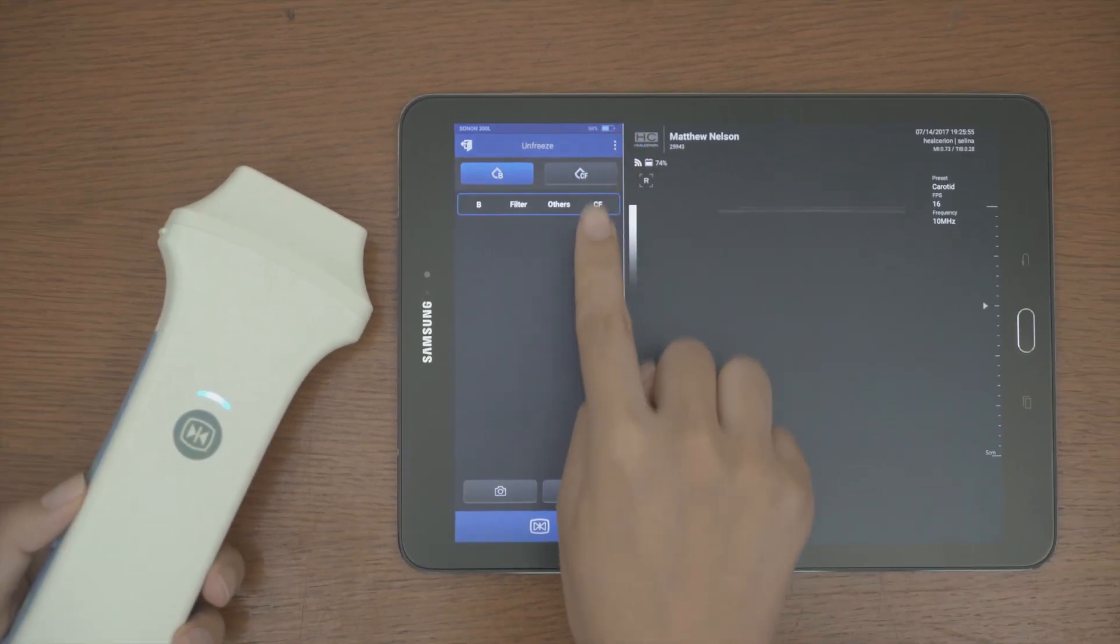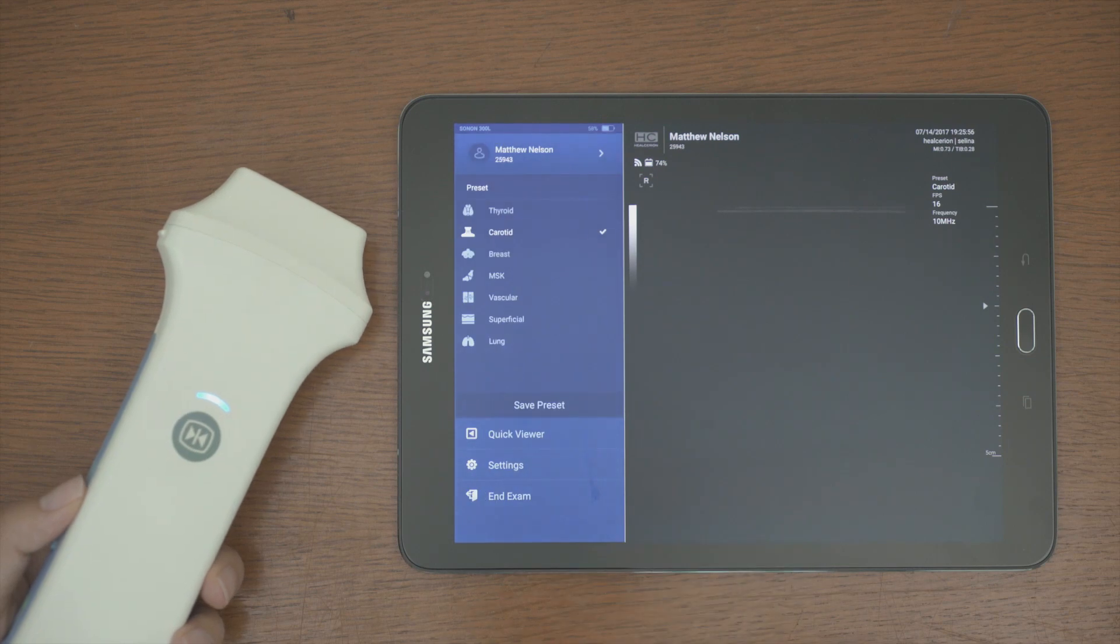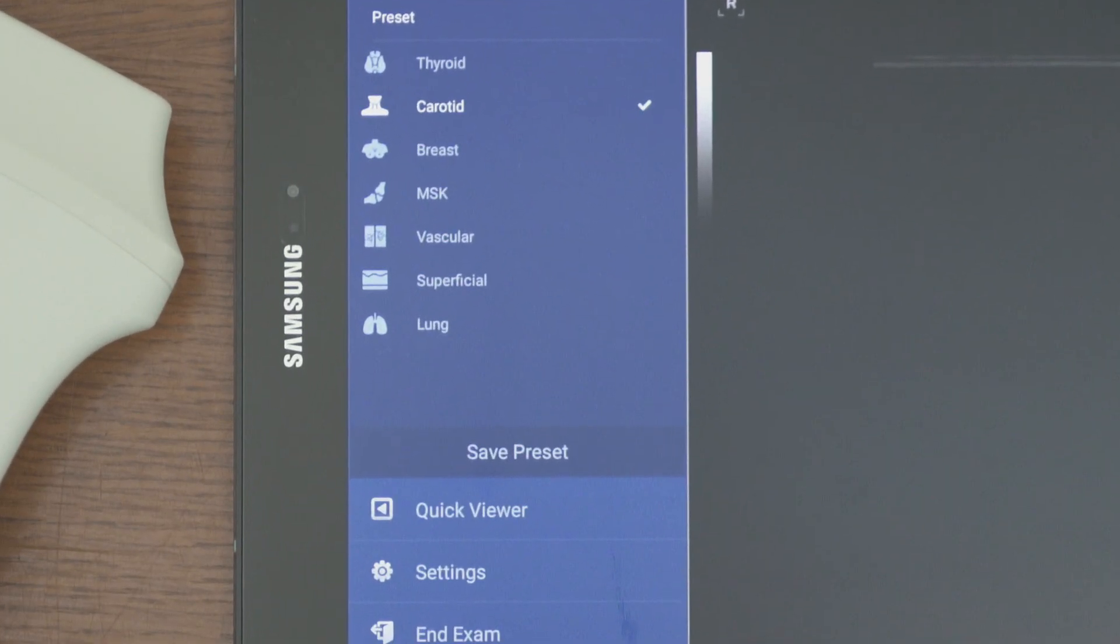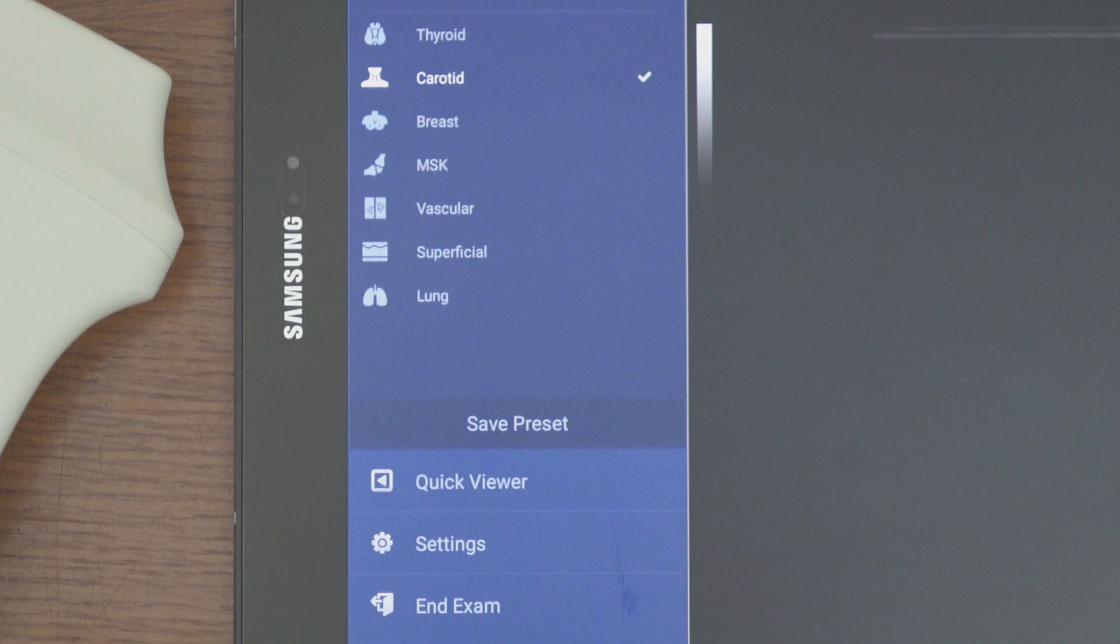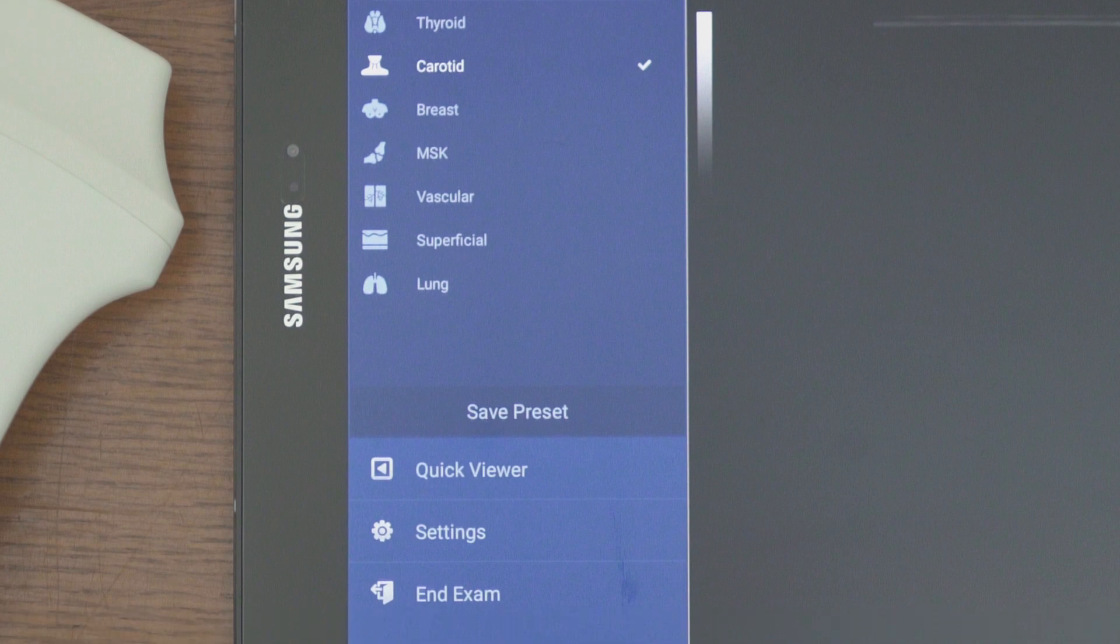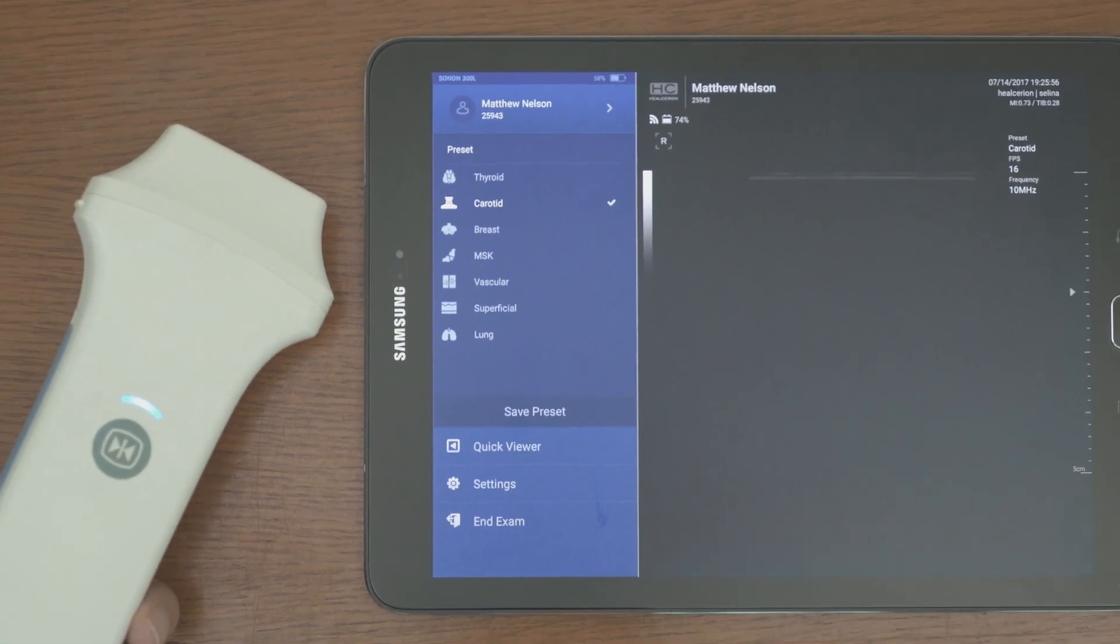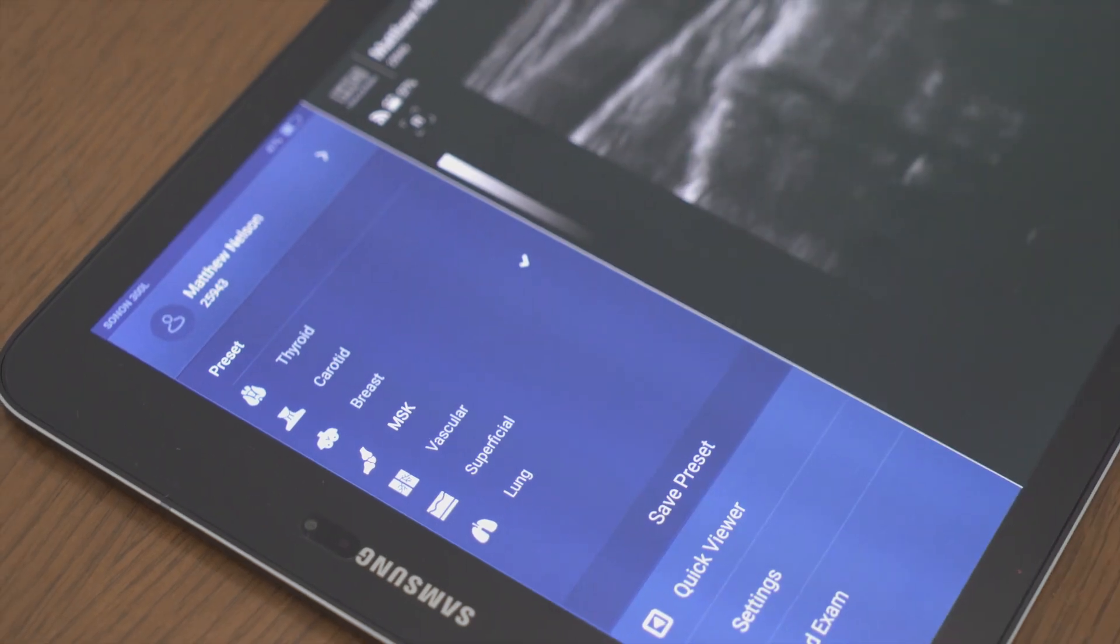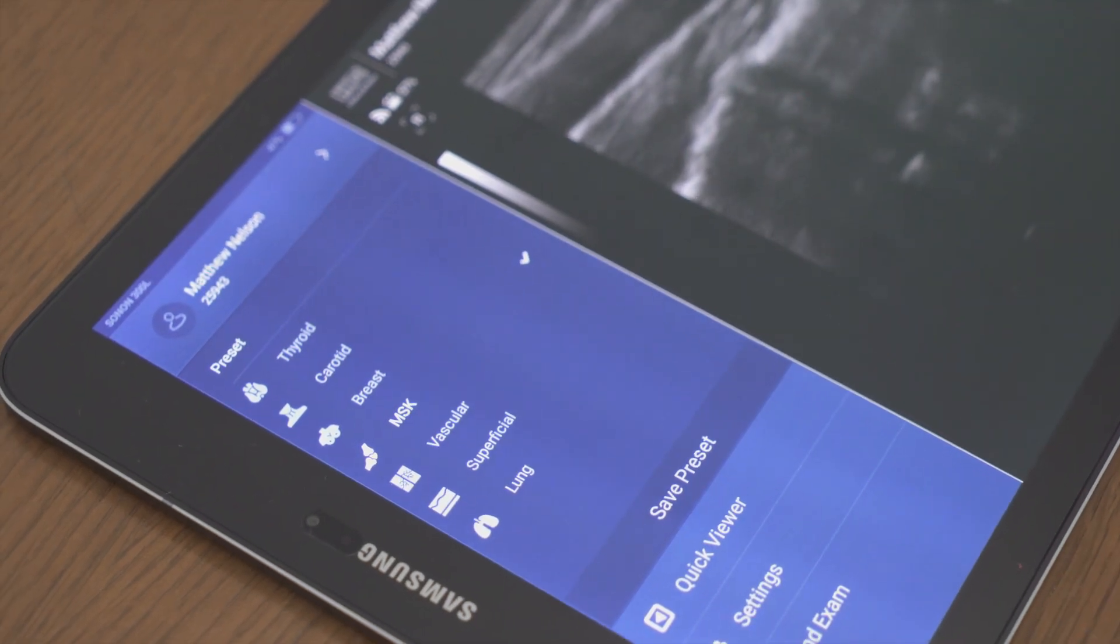Before starting to scan, set the preset from the menu button. Thyroid, carotid, etc. are preset for each part. Each preset can be changed according to user's preference and user preset can be created or changed.